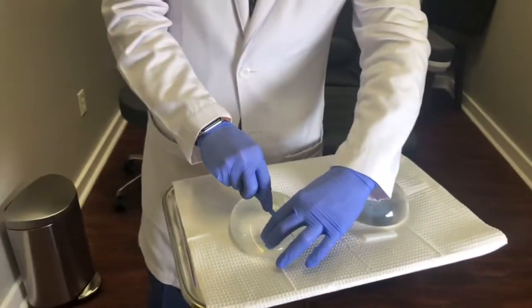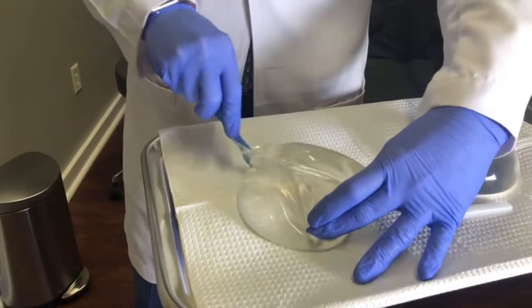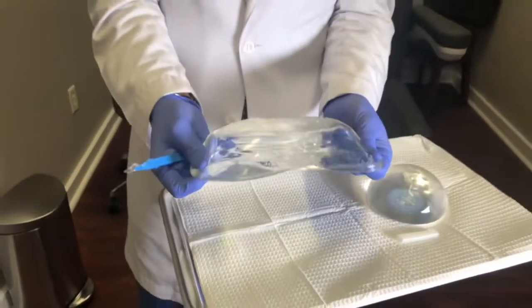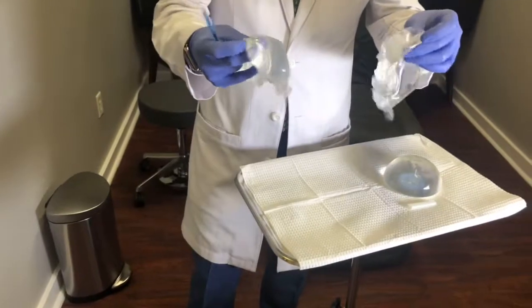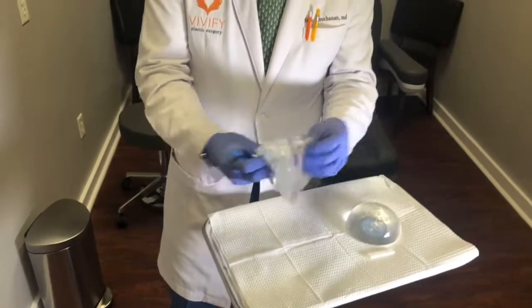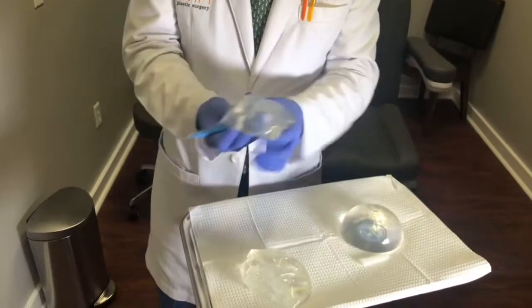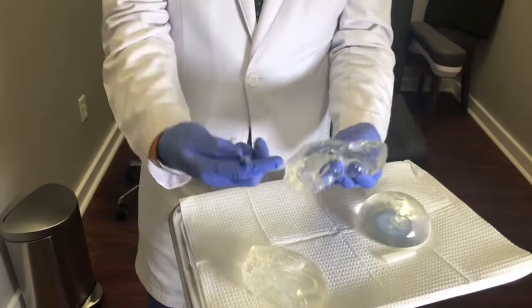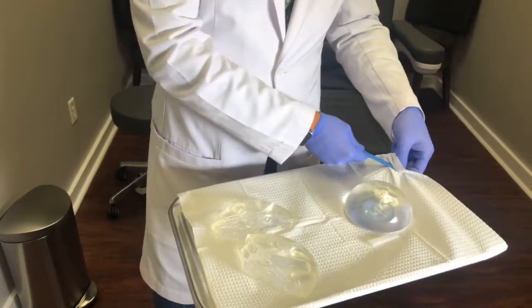I'm just going to take the scalpel here and cut this implant. You can see this implant has a little bit more of a sticky gel. So if this implant were to rupture, you can see this is a little bit of the older technology where the gel is a little more sticky — it's stuck on the knife here. I'll show you compared to this next implant.